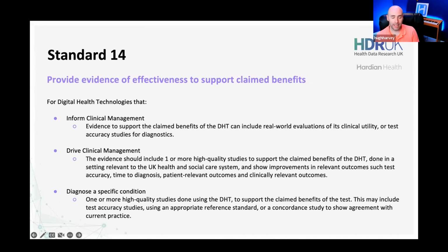Especially if you are intending to be a standalone diagnostic device, where a clinician relies solely on the output of your device to make a diagnosis, you will quite likely be class 3, especially if the diseases or conditions that you're diagnosing have a morbidity or mortality associated with them. So for instance, if you are diagnosing stroke on a CT scan, that would most likely be a class 3 device, because stroke is a critical or severe condition.